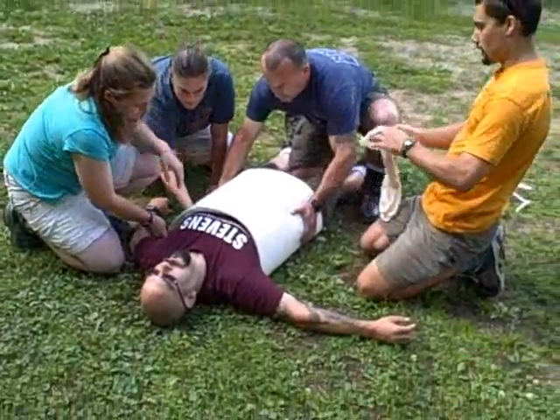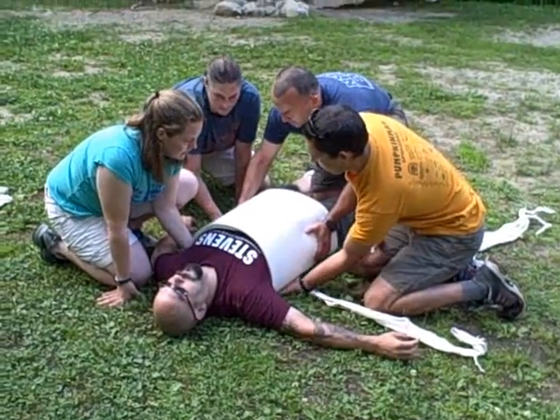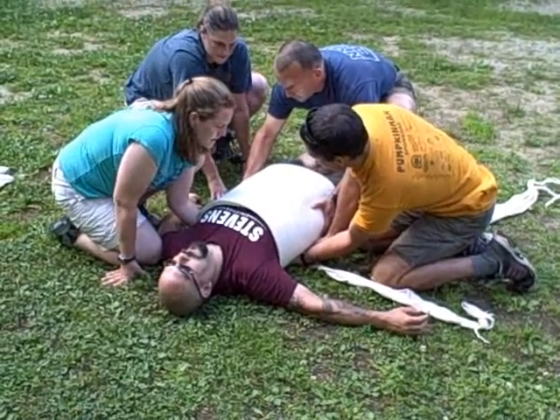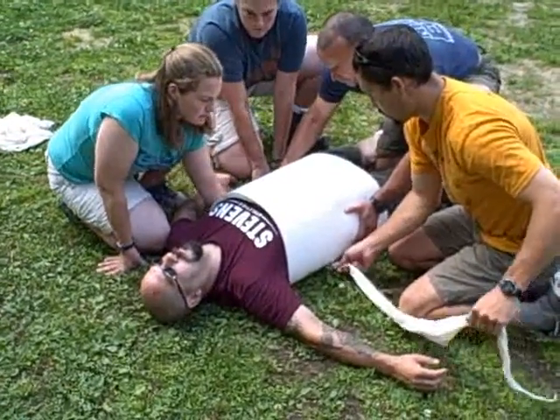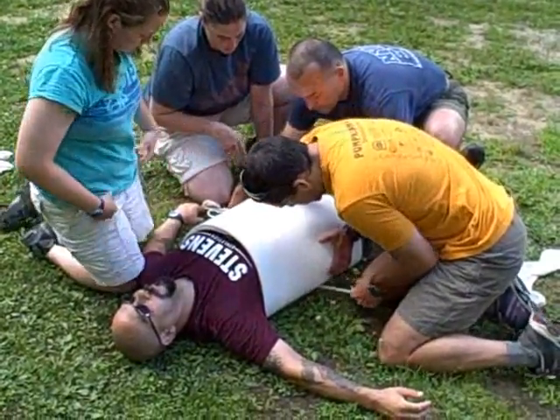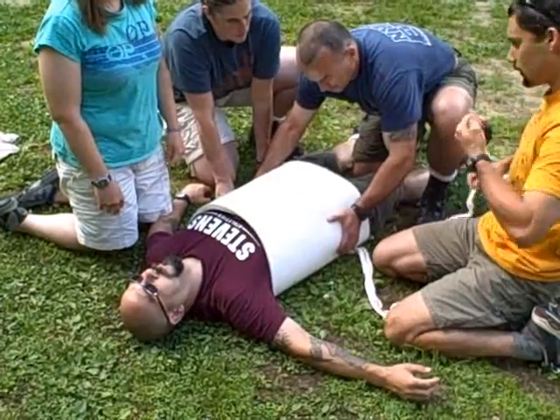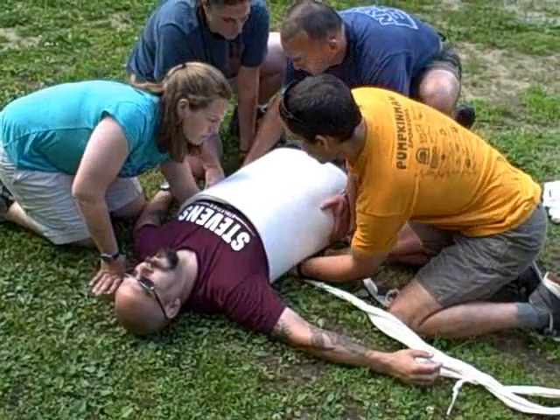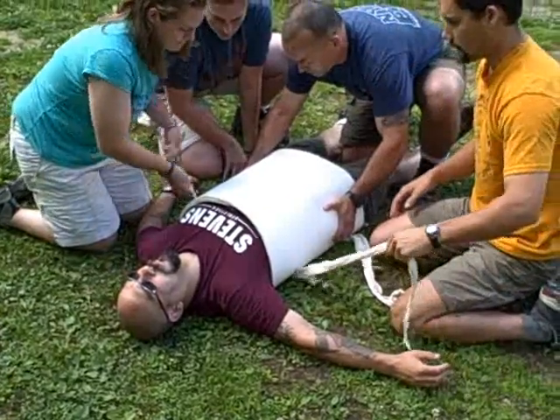So now we're going to use some cravats to tie that in place and keep that stabilization. I'm just going to take this — Dana, I'm going to pass it to you under the small of his back here. Got it there? Go ahead and slide that through once you get it. Then we'll take this and kind of bring it down a little further, down at the bottom of that one. Do the same thing with this one here — I'm going to pass it into the small of his back to you again. Pull that one right through.